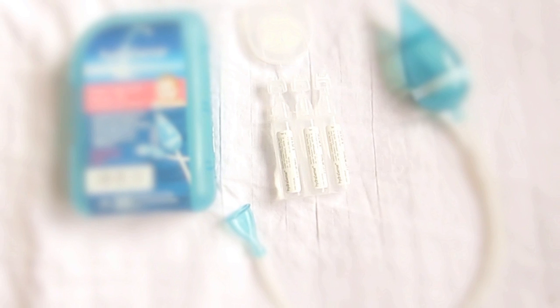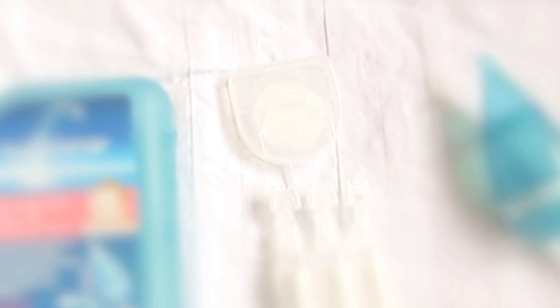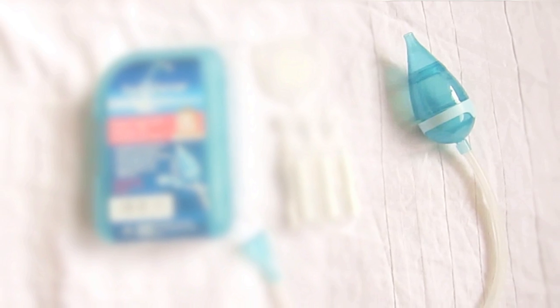The kit contains the following items: five vials of saline solutions, five filters, and one nasal aspirator.